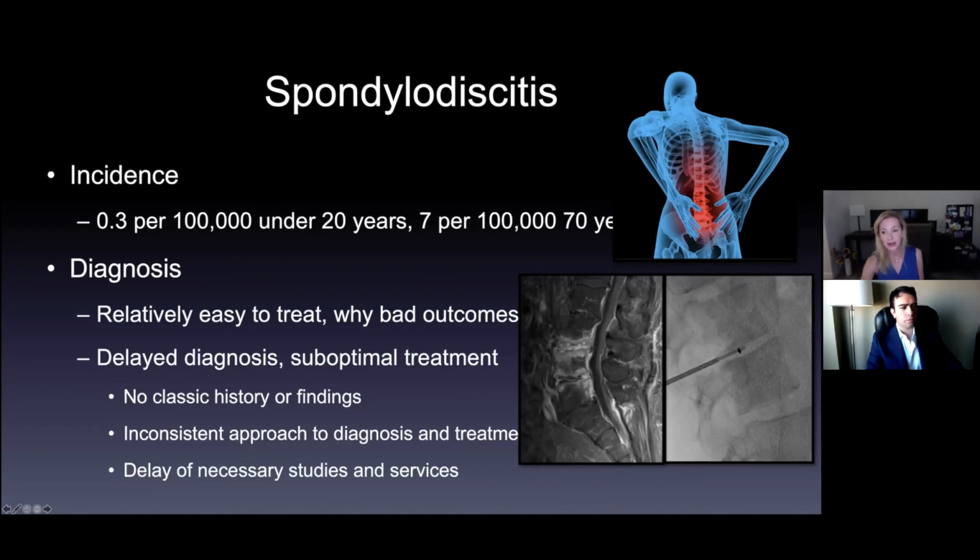And this is a picture from the biopsy I did on this patient. So Dr. Baj mentioned that radiologists do procedures too. And that's true. This is one of the most common ones. We do percutaneous biopsies for discitis. I think only radiology does those. I don't know if surgery does those at all because you would do the open biopsies. But if we get to it, I don't know if we're going to get that far.